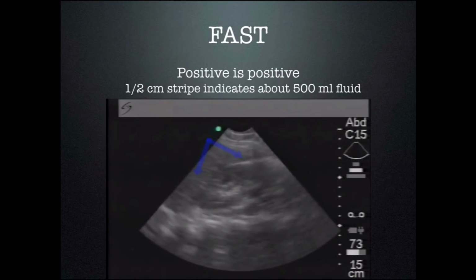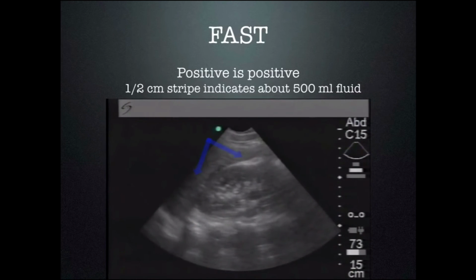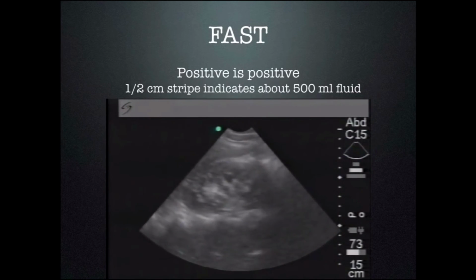The scale, as you can see on the right side, is very small. Each one of these dots represents a centimeter, so this is about a half a centimeter stripe of fluid, and that indicates about 500 milliliters of fluid in the abdomen. Again, a small stripe of fluid is significant. It's a large amount of blood.